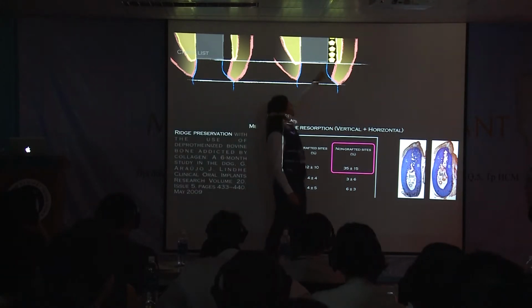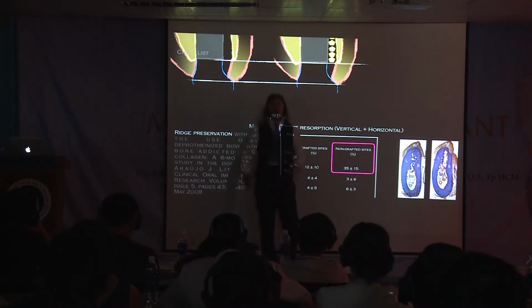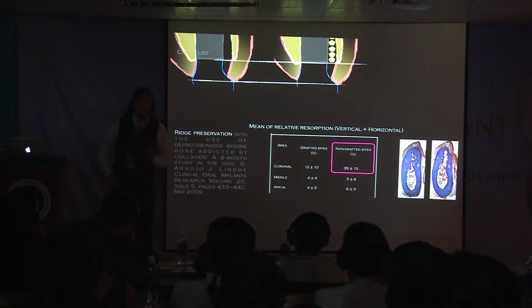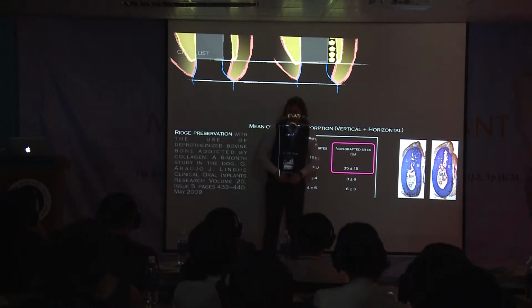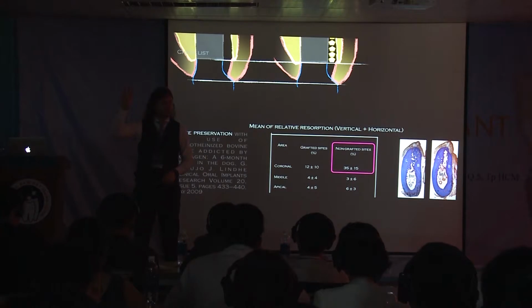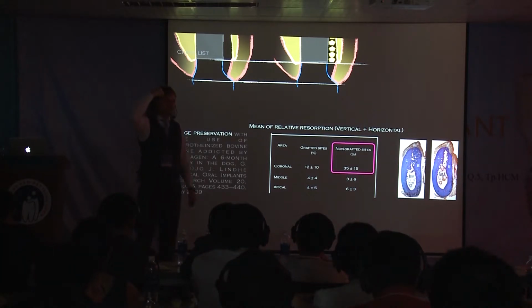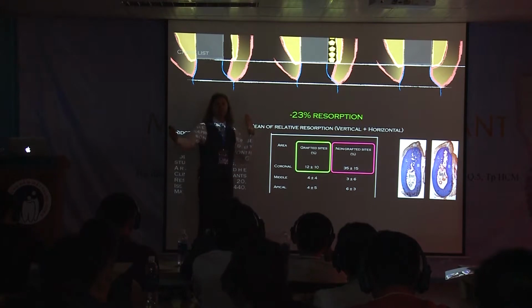It's critical to know the distance between the implant and the bone. This distance should never be less than 2 millimeters. This is the minimum. Better 3, perfect 4. I repeat, because it's very important. The distance between the implant and the bone: minimum 2, better 3, perfect 4. So you take this number and you stick a post-it here, in this point. We will go back later on this number. Because we can obtain minus 23% of the horizontal resorption.